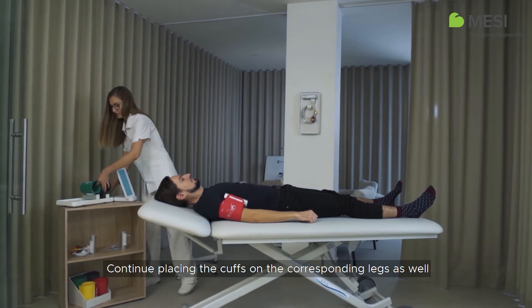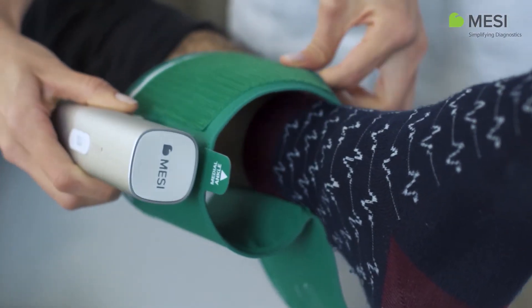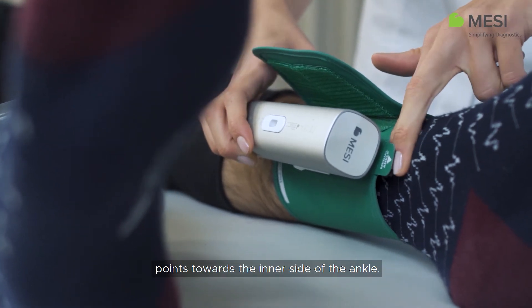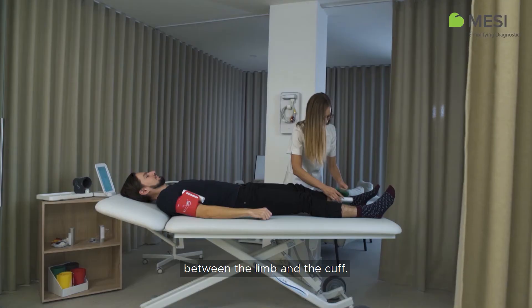Continue placing the cuffs on the corresponding legs as well and position them two to three centimeters above the ankle. Make sure that the arrow-shaped medial ankle marking points towards the inner side of the ankle. Place the cuff so that there is two fingers width of room between the limb and the cuff.